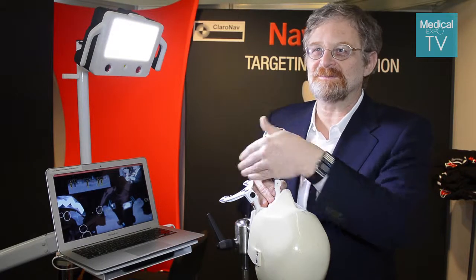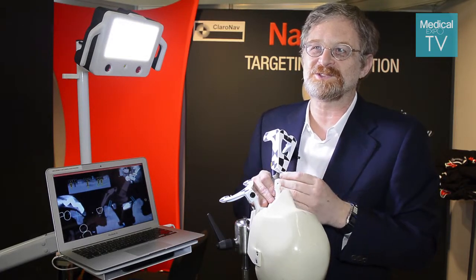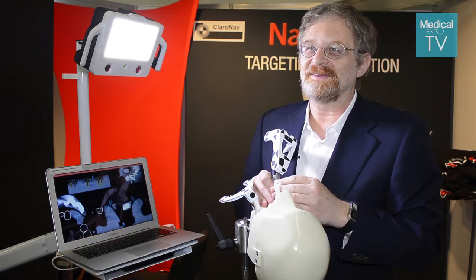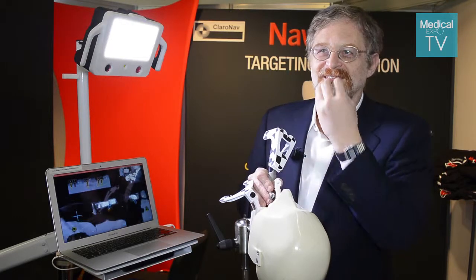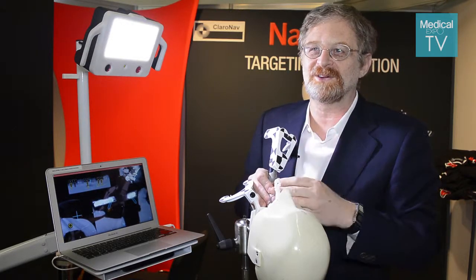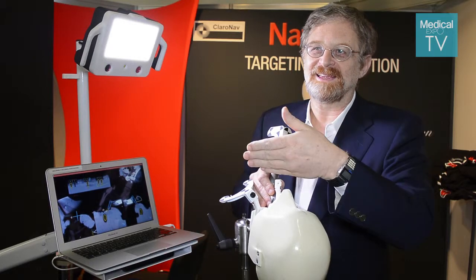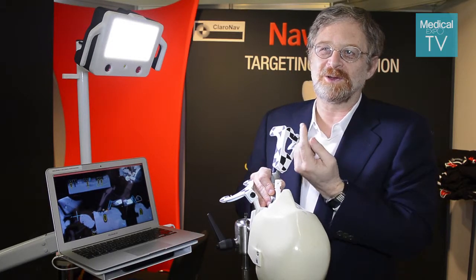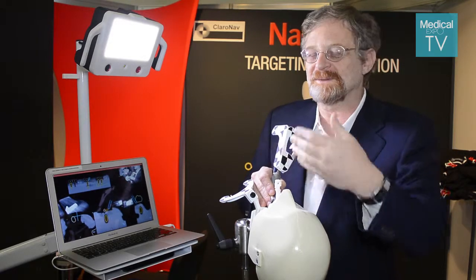We offer the system including the training and the planning software for $20,000. They also buy a kit per procedure which includes the plastic tags and the stand they put in the mouth, and we sell those for $59 per implant placed. So if they place only one implant, they pay only $59; if they place two, they pay twice as much, and so on.